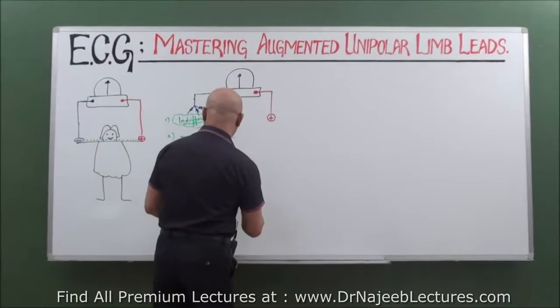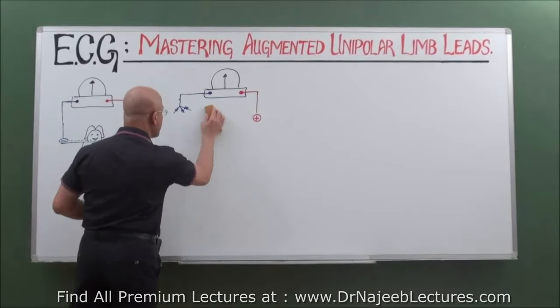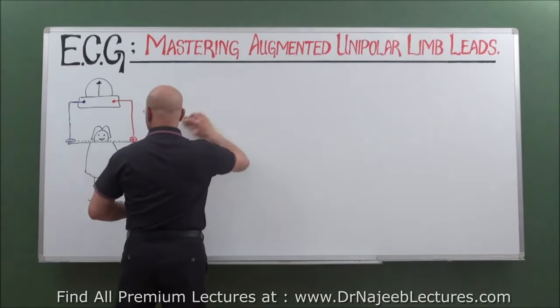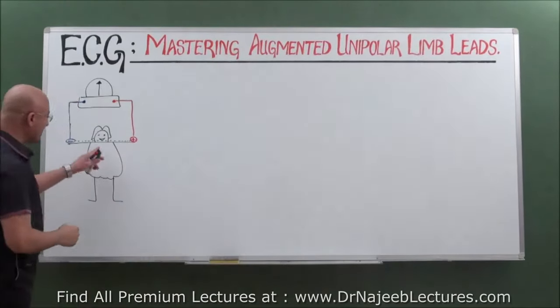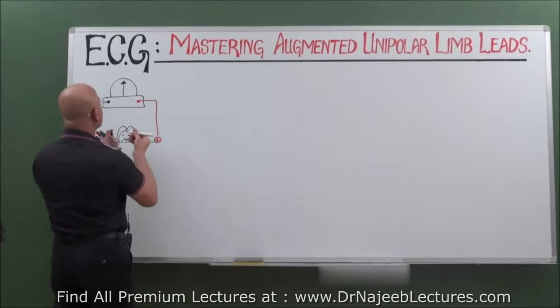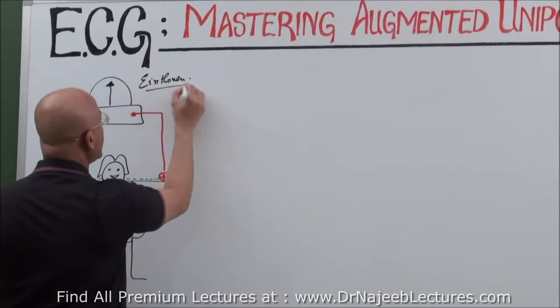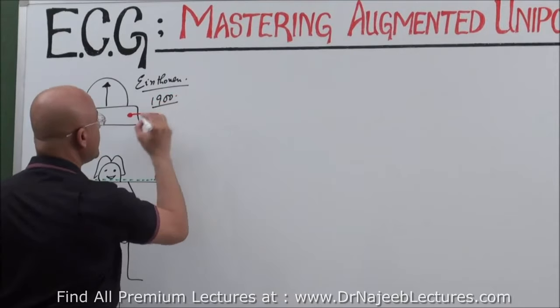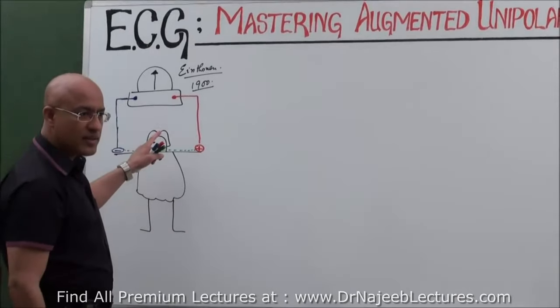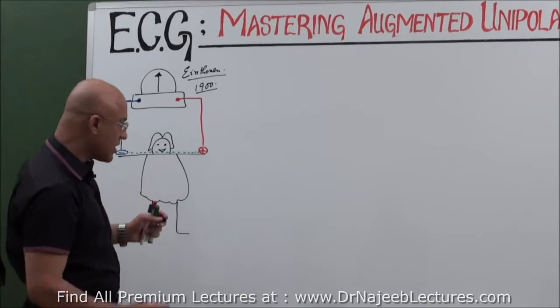Let's suppose we go back to bipolar and then we'll come back to our unipolar system. When we talk about bipolar leads, let me draw Einthoven's triangle here. It was Mr. Einthoven who made the bipolar leads around 1900. The real trouble started here. Dr. Einthoven made bipolar limb leads, right?